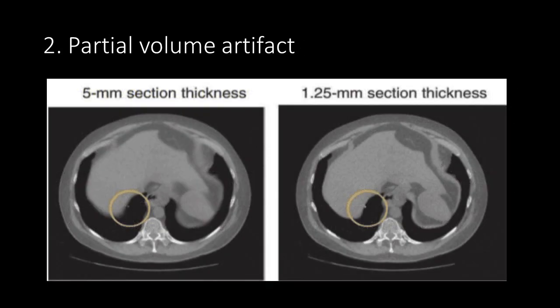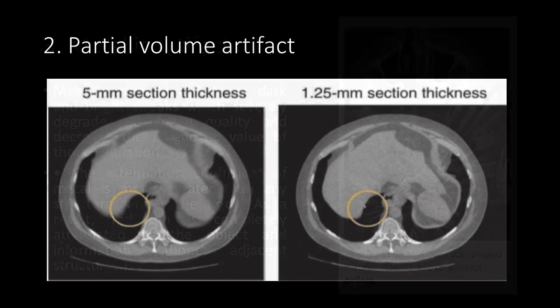In this patient, we can see partial volume artifact, circled in yellow, decreases with thinner slices.